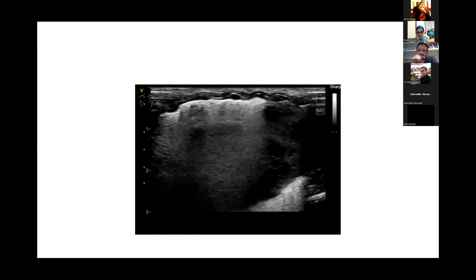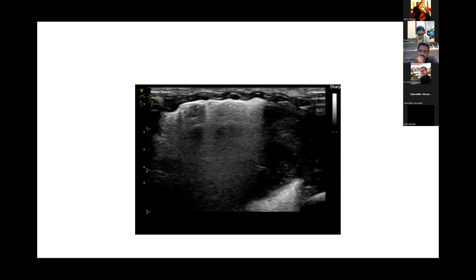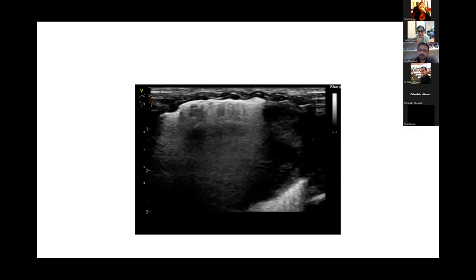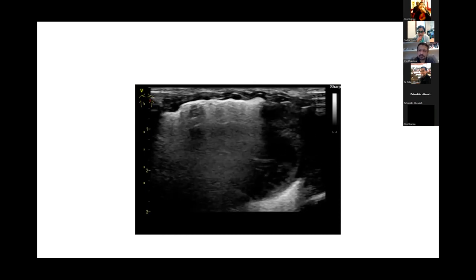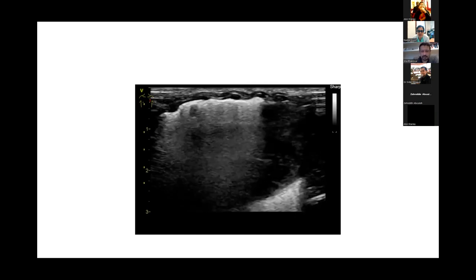And again, this is something probably very rare in children and in the newborn as compared to adults, but we don't really know. And then the dynamic, if we could see your last scan on the left, Suman is wondering whether it's a dynamic bronchogram.